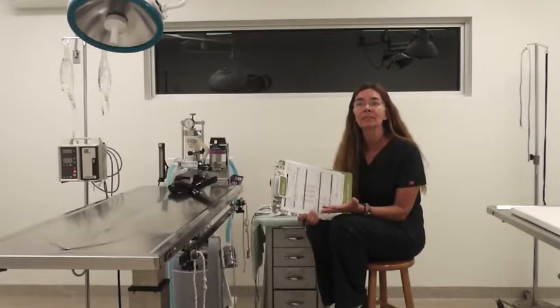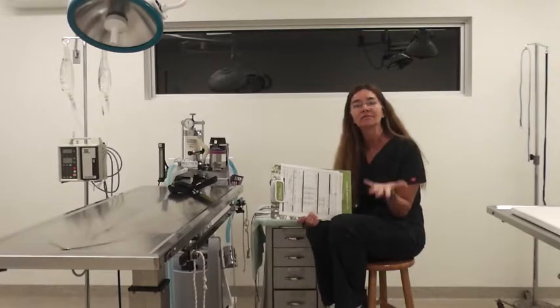So monitoring the heart rate and the heart rate rhythm is very important. It tells us the overall status of the circulation, how the heart is pumping. We want it pumping at a good, strong, good steady rate and a good steady rhythm. We want to make sure it's not too fast, not too slow. We want to make sure it's beating adequately to move oxygenated blood through the tissues and to other parts of the body. That's really, really important when they're under anesthesia.